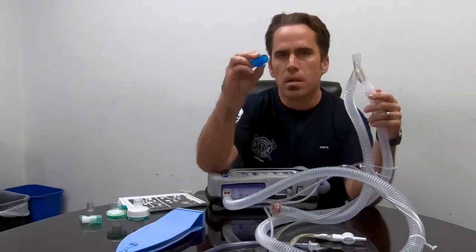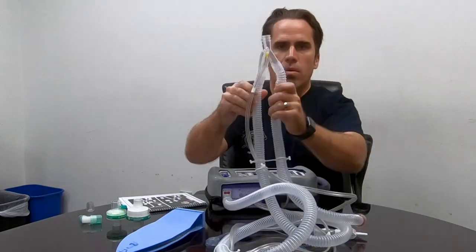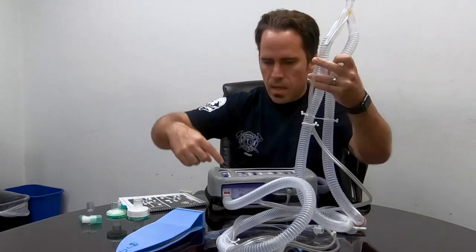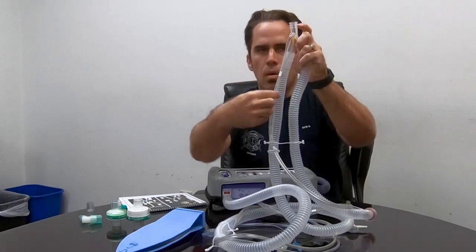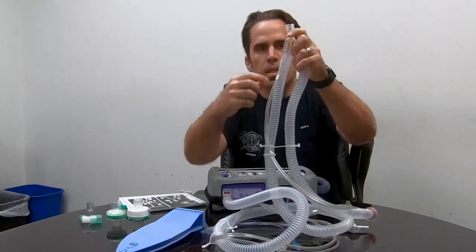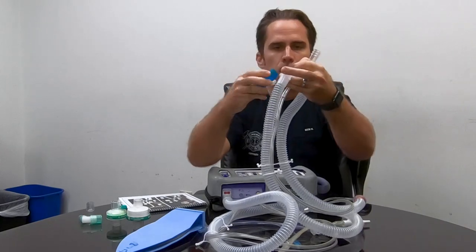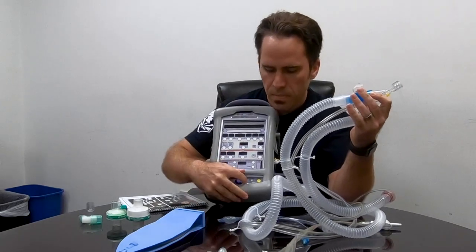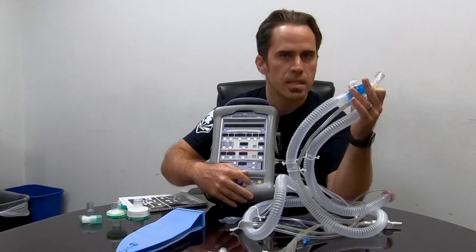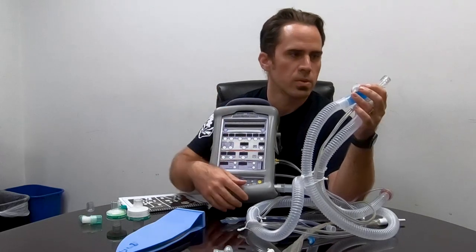This is our metered dose inhaler adapter. Where does it go? It goes on the inhalation side. The inhalation side is the long tube that goes from the vent all the way up. You can also look at where the cords or wires or tubes are pointing, and this coupling looks different and is easier to remove. We put the metered dose inhaler on here.